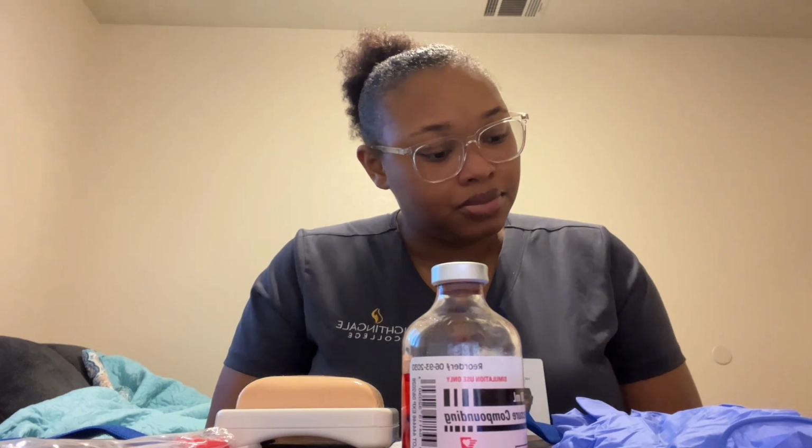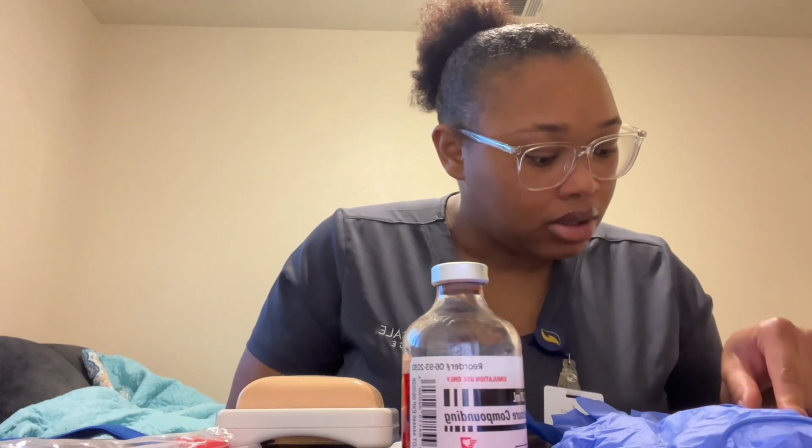So I will gather my supplies, go to my patient's room, knock on the door, and provide patient privacy. I would also check to make sure my patient doesn't have any family members in the room. My patient doesn't. I would introduce myself. Hi, my name is Talisa. I'm going to be a nurse today. Can you tell me your name and date of birth? I would verify that on the armband. I would do my second medication check.